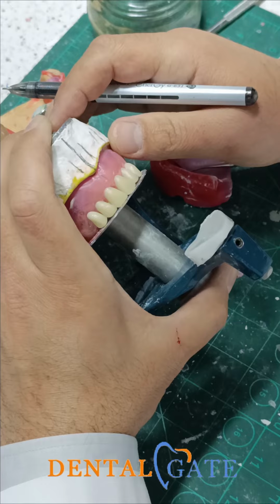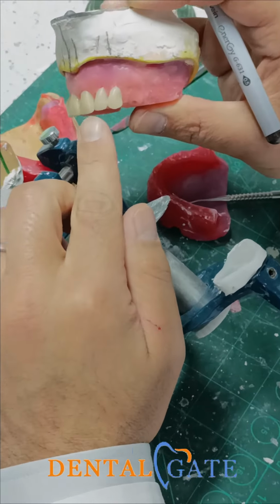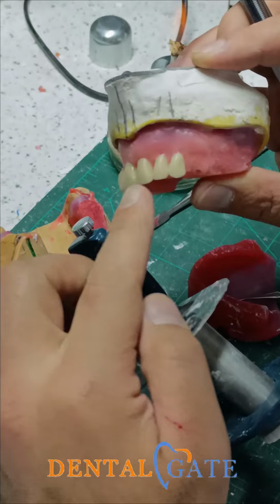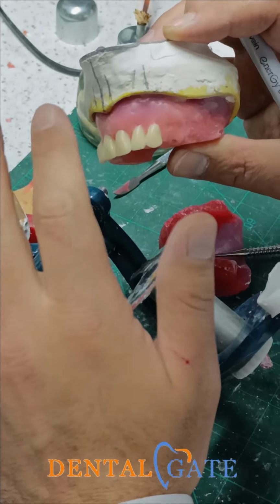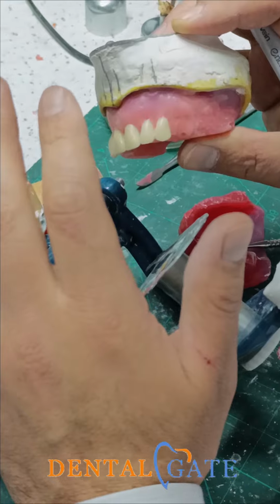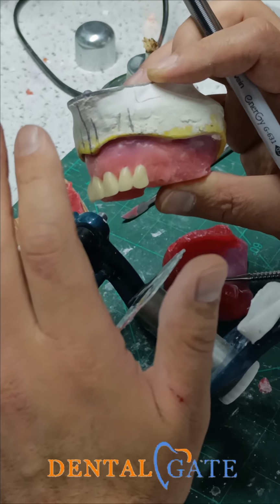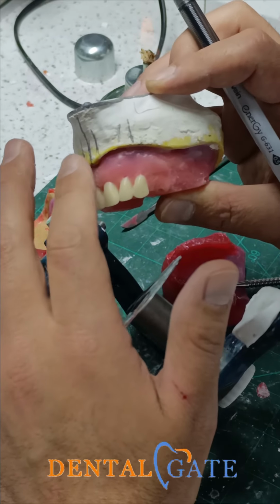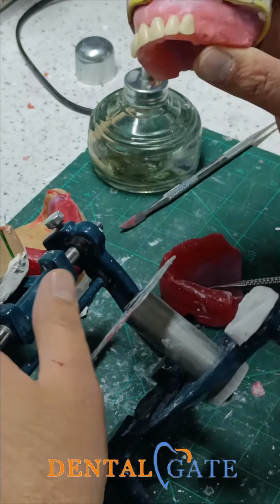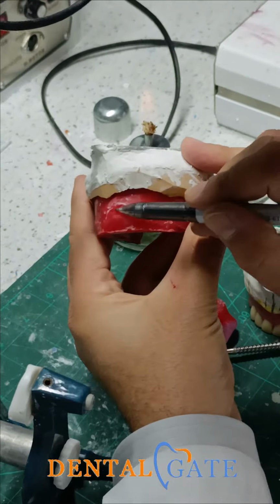When I make an evaluation, I check the central incisor from the distal surface, it will be protruded labially, but to a limited level, okay? Because we have a support for the lip line. You can remember our bite rim, it will be protruded labially, okay?